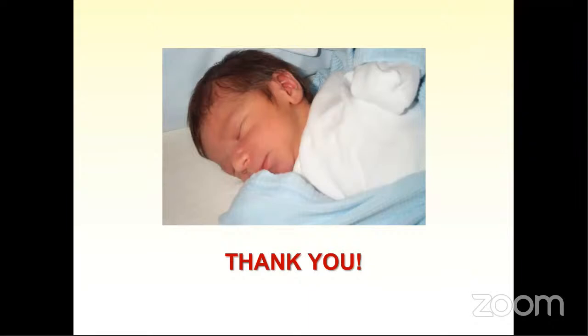Thank you, Dr. Rubin. My question is, when we used to use SensorMedics in my previous hospital, we had to keep the alignment of the connection between the machine and the baby, which sometimes is really difficult, keeping the hanger for the tubes at the same alignment for the SensorMedics to transmit the high frequency properly. Technically, we found difficulties in that. This is like a technical issue.